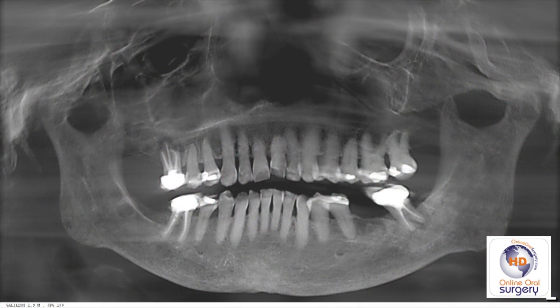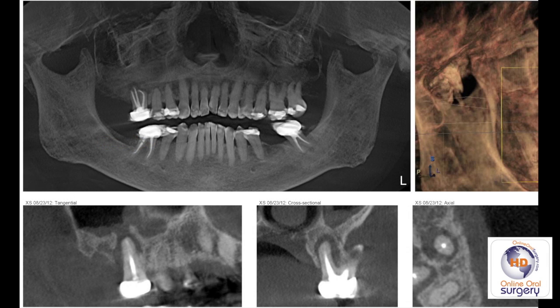Our radiograph of choice in this case is going to be a cone beam CT. Here you see the Galileo's panoramic projection of this patient's jaws, and you'll notice right away that there's some type of radiolucent lesion at the apex of tooth number three.